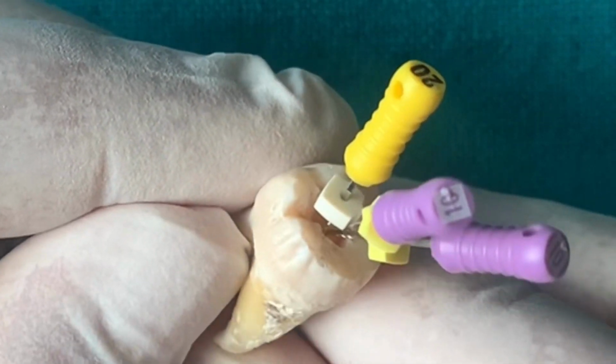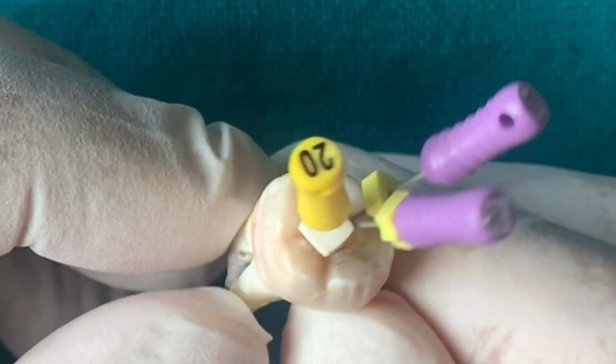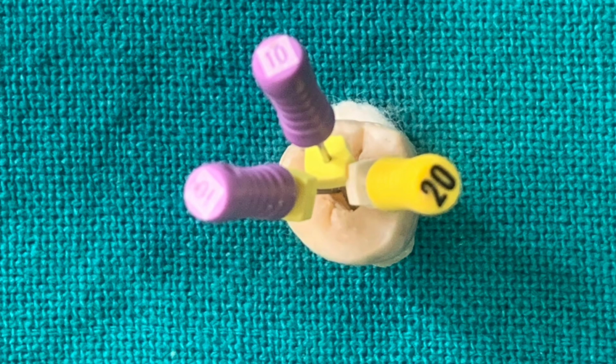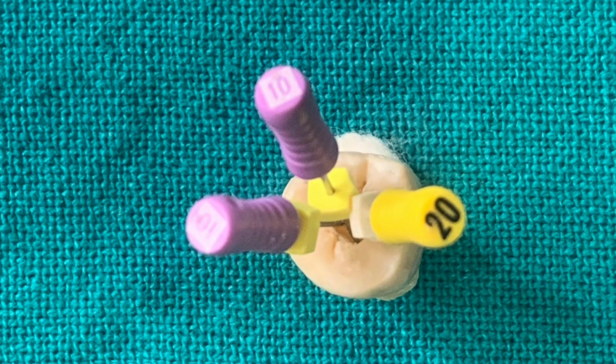Well, maxillary molar is a difficult tooth, and if you are going to start a maxillary molar RCT, do practice first on an extracted tooth before attempting it on a patient.